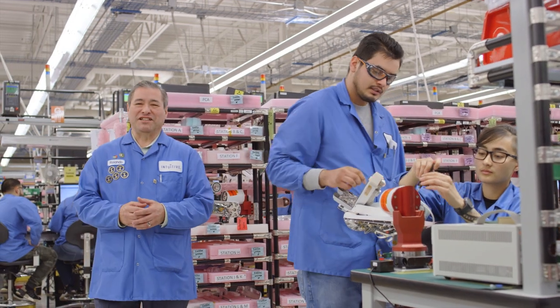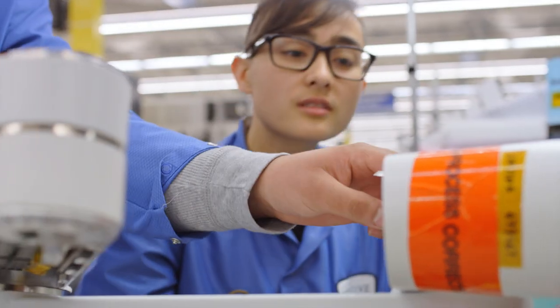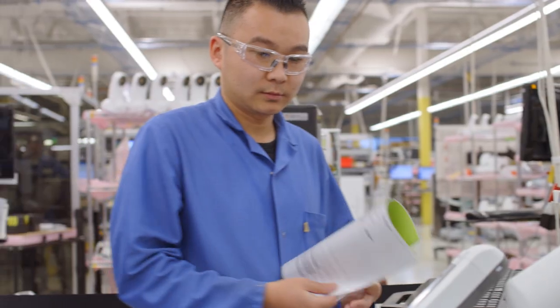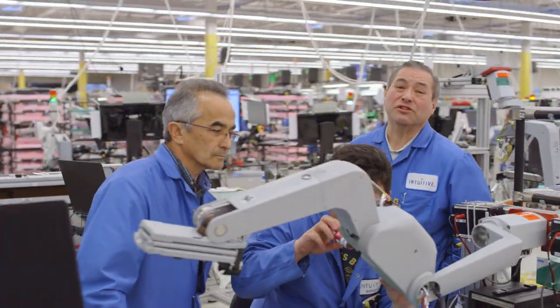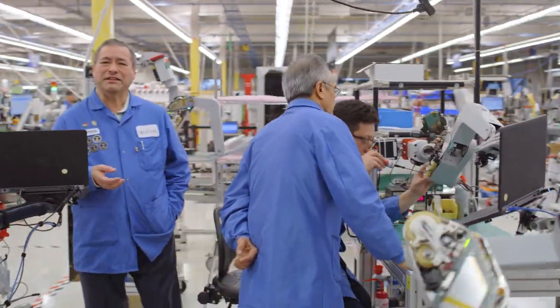The training of our technicians takes about 30 days per station. They sit side by side with the trainer all day long, every day. The end training phase is where the technician learns to master the assembly through controlled work instructions. The mentoring phase is where a technician learns how to improve their efficiency. The focus is on how to hold and use tools to improve their productivity.